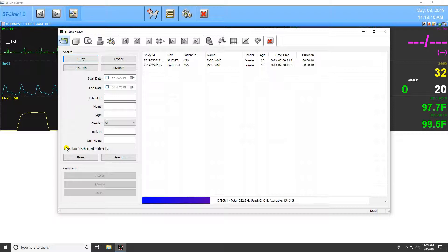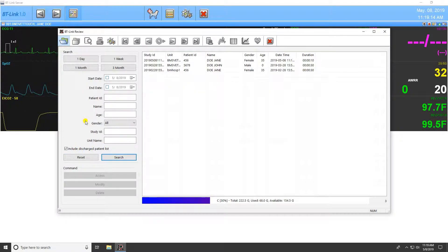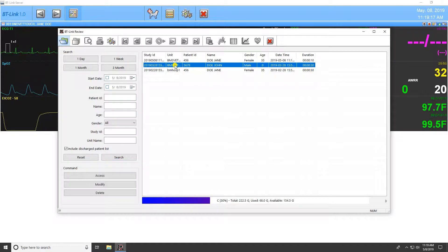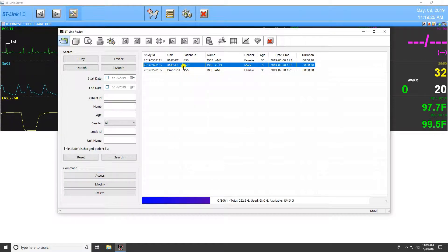Simply click the Include Discharge Patient List button and press Search with all fields left blank to display all admitted and discharged patients. Highlight a study by single clicking on it, and the buttons at the bottom of the screen allow you to modify the patient data of the study or delete it entirely.